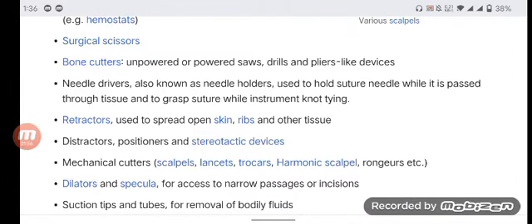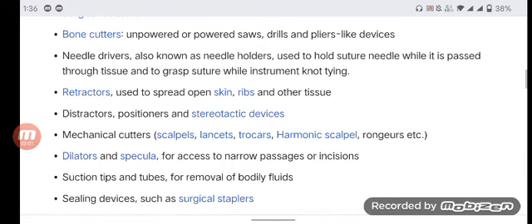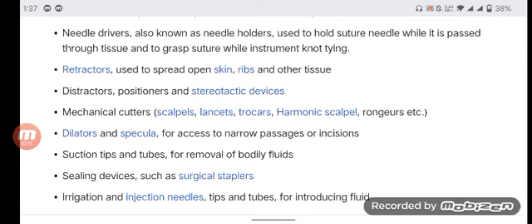Needle drivers, also known as needle holders, used to hold suture needles while passed through tissue and to grasp suture while instrument-tying. Retractors used to spread open skin, ribs, and other tissue; distractors, positioners, and stereotactic devices; and mechanical cutters.